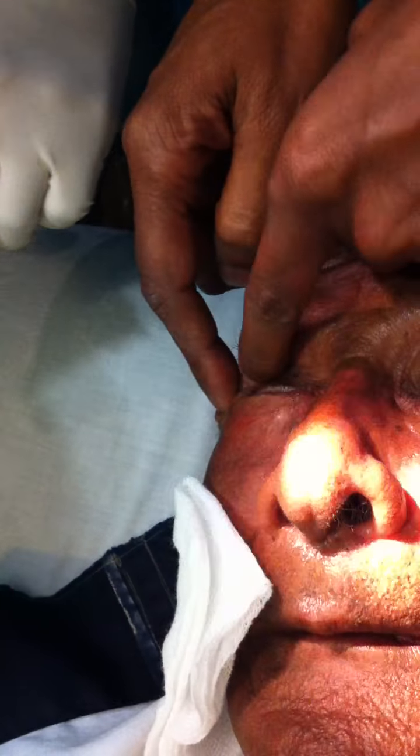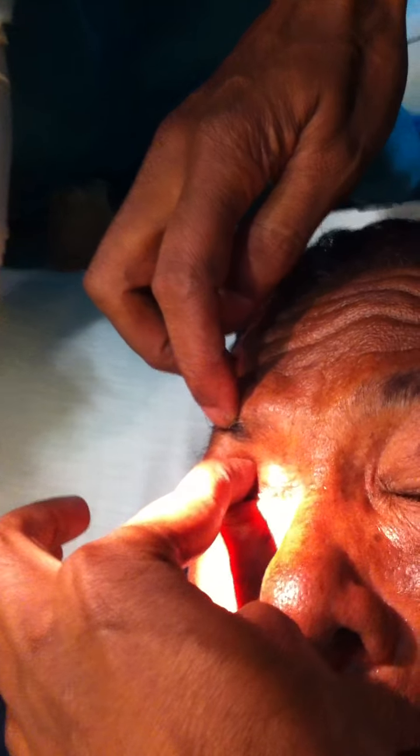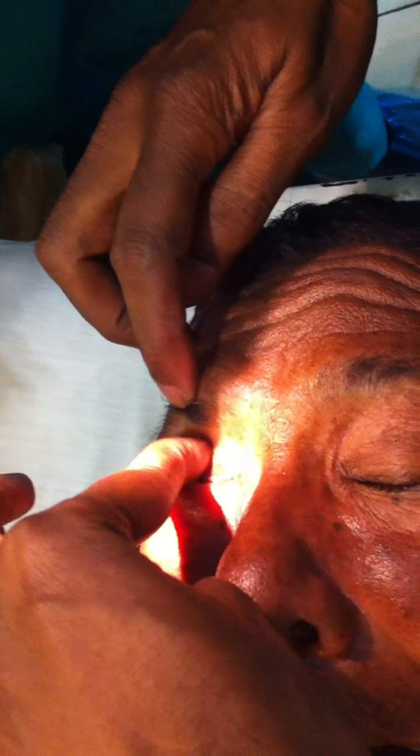So this is the lateral approach — here is the area. Here you can push the globe down and use the nail of your index finger to protect the globe.